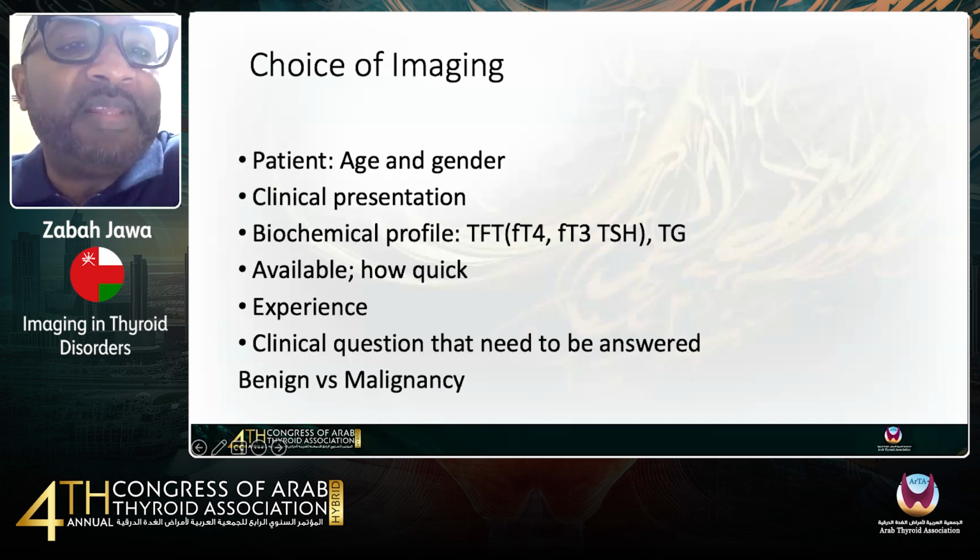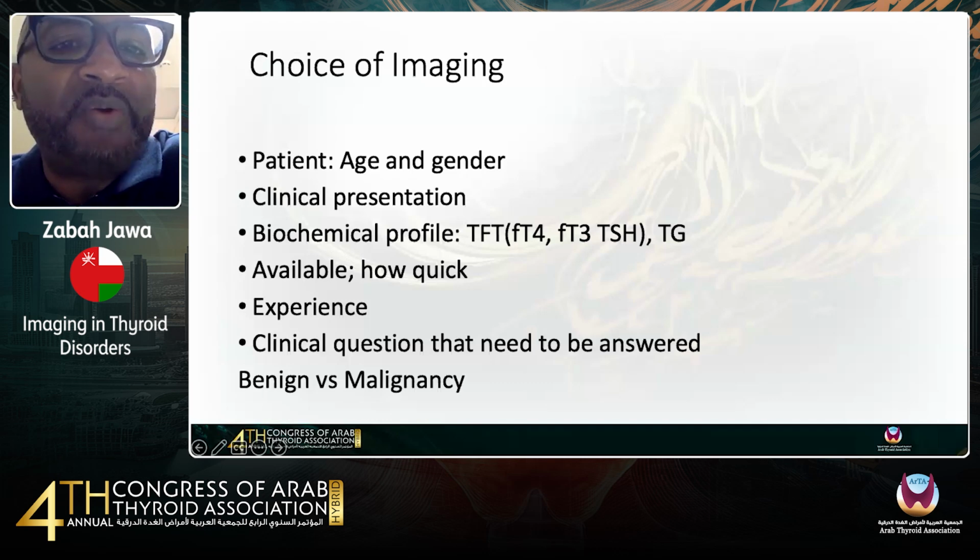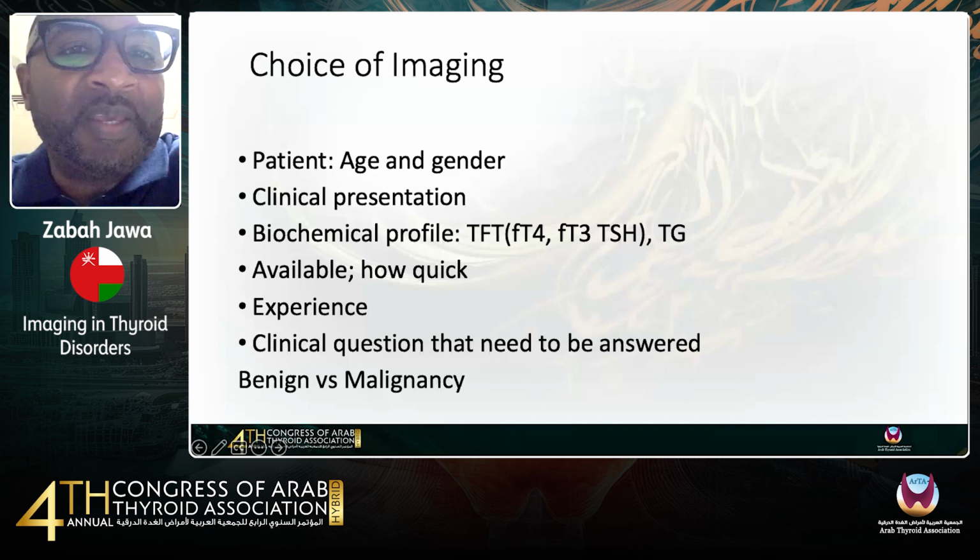Another thing that will determine the choice of your imaging modality is how available the imaging modality is and how quickly you can get it to answer questions. And of course, your experience. Some people are more experienced with thyroid scintigraphy, others with thyroid ultrasound. So it is important in deciding which imaging modalities you have to do.